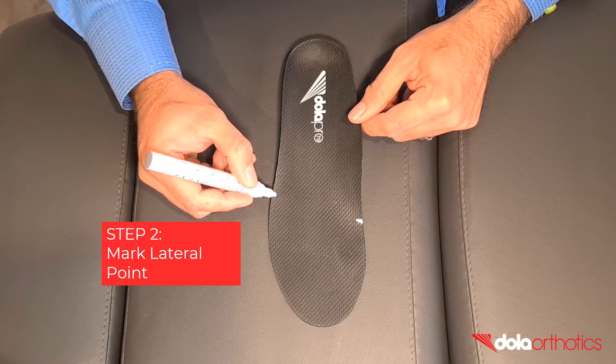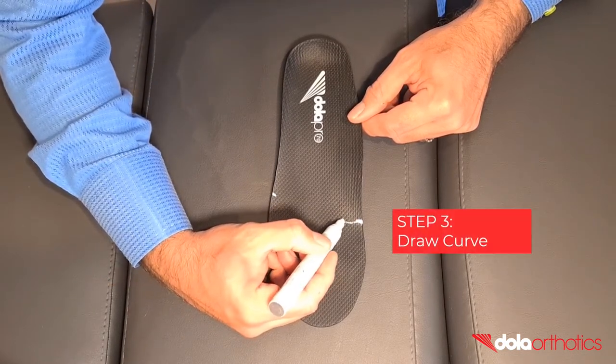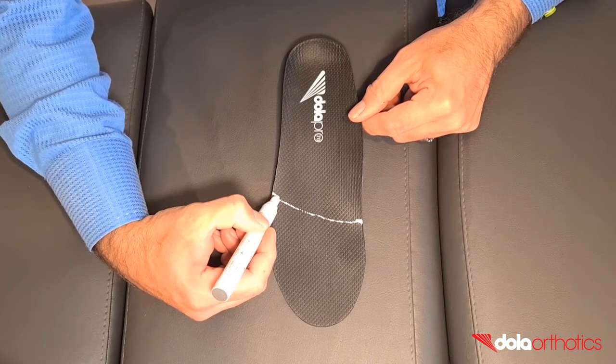Step 2: Mark the lateral point of the curve. This will commonly be a point behind the fifth MPJ. Step 3: Connect the two points in a smooth curve to match the metatarsal parabola.